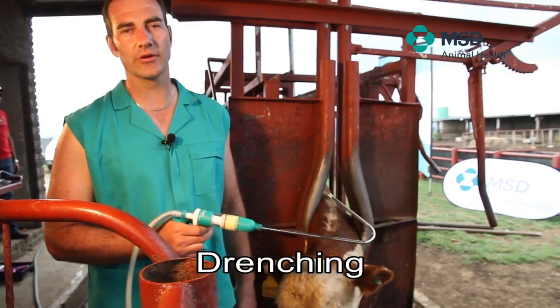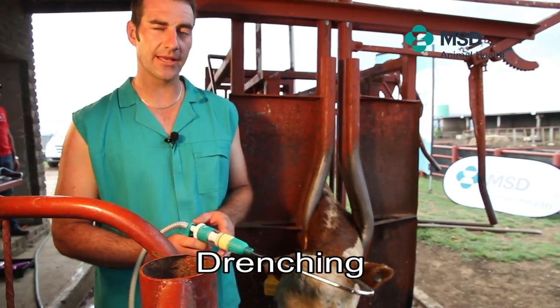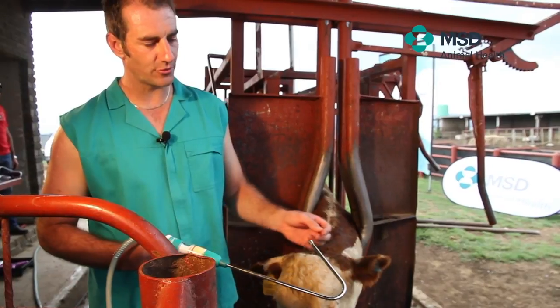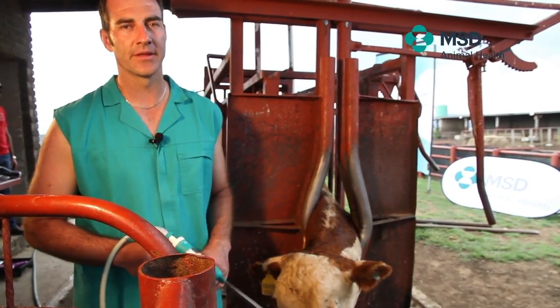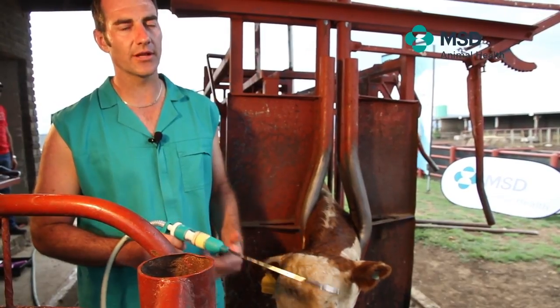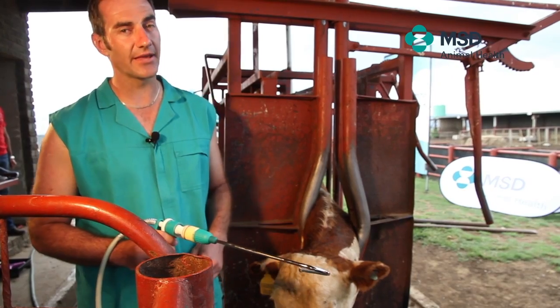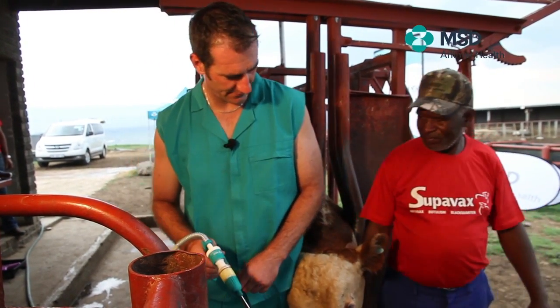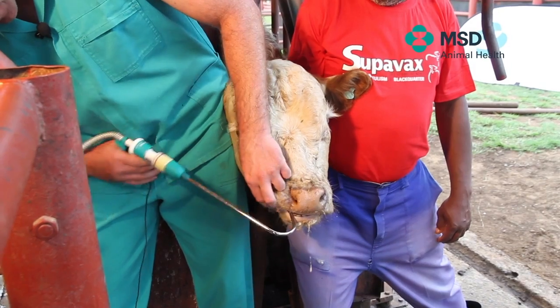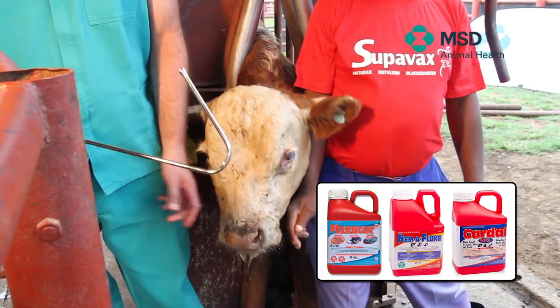The next technique we're going to explain is drenching. Make sure that the gun that you're using is correctly calibrated and make sure that the hook is free of burrs or any sharp ends to prevent injury to the animal. Then you must make sure that the animal is correctly restrained, to prevent injury to the drencher and the animal. Make sure that the drench is aimed at the cheek and that you don't do it too fast because that can cause aspiration.